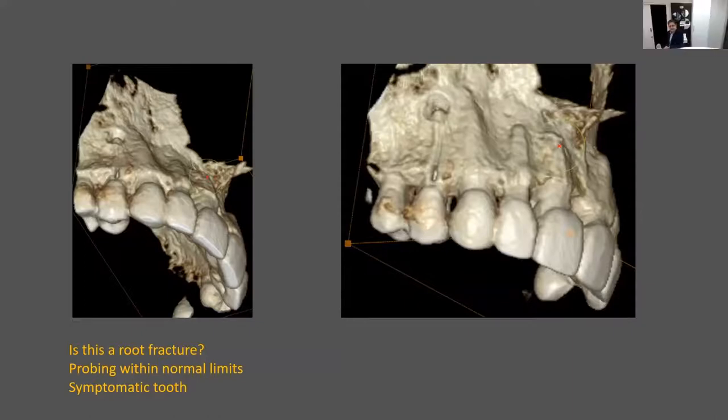The interesting thing is that when I look at the CT scan, I spend a long time with each patient. I've had good colleagues, maxillofacial surgeons, who spend time together, and also in London and here. And I've been going through every section slowly. There's no way I would pick this up if I didn't go slowly and find that defect, because it's so obvious. The one thing is to take the scan.